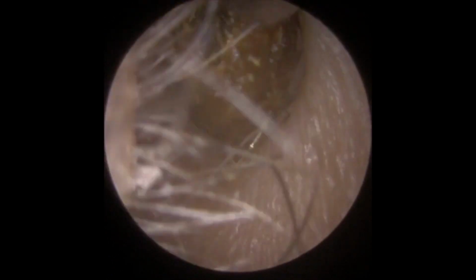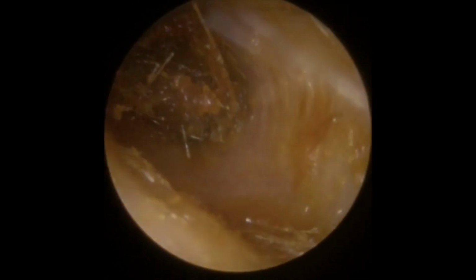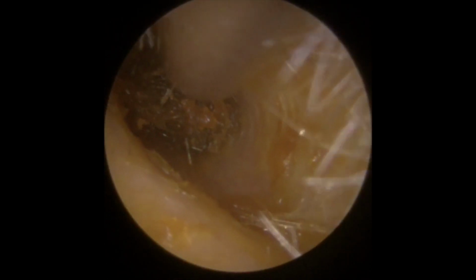There you go. It's on the move. Just wiggling to unstick it, move it down the canal. A little bit broke away, so just going to get the rest of it now. There it is. And you can see there's a little bit left in here, so we're just going to go and grab that piece as well.